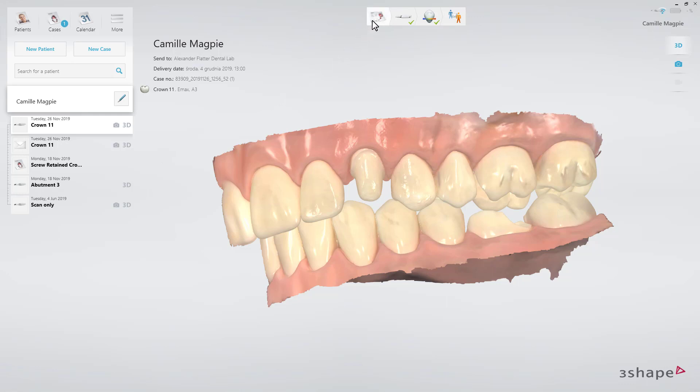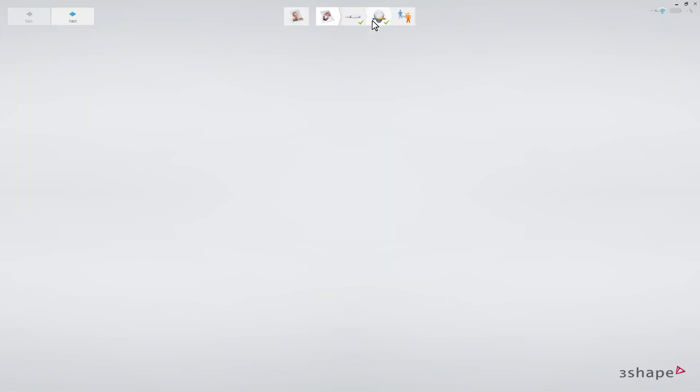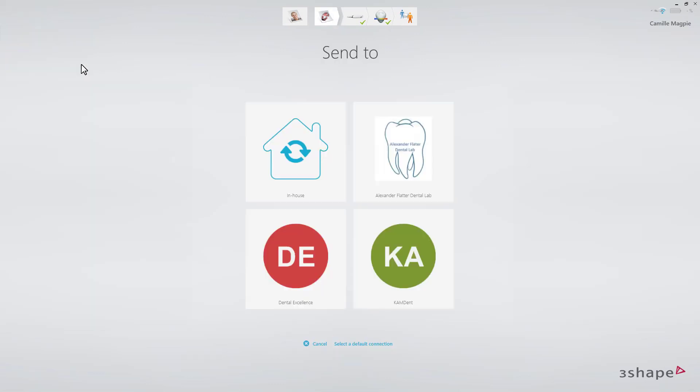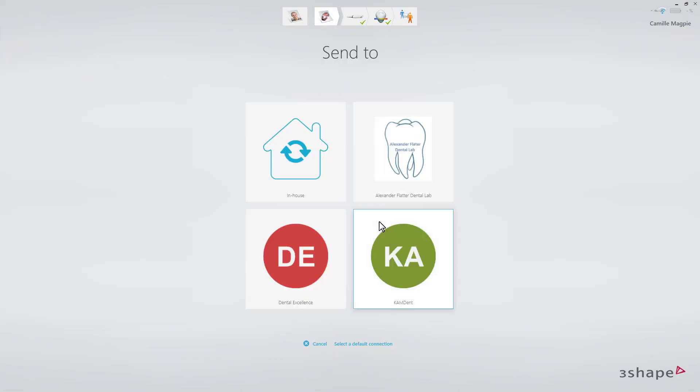Now perform the changes you need — for instance, change the lab to a different one. To do that, select a new lab in the Send To section, and choose a different lab.